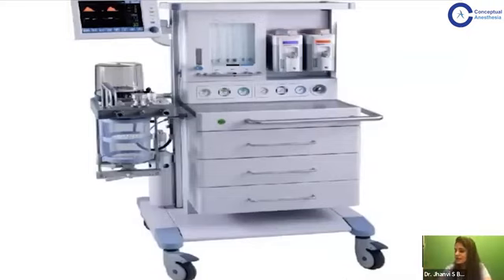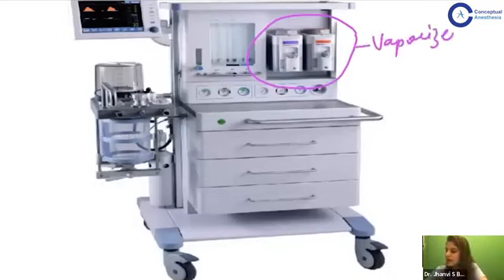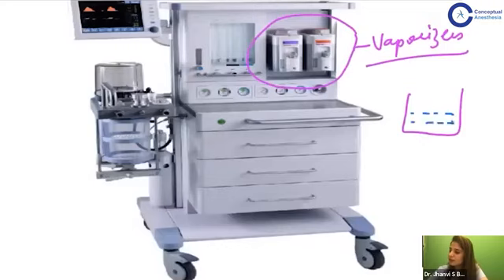So now this is the anesthesia machine, as all of you can see. And what is this that you can see here mounted on the top of the machine? Yes, these two things that you can see, these two dabbas, they are called vaporizers. Okay. What does a vaporizer do? Basically, the vaporizer will have liquid anesthetic agent in it, and it will convert this liquid anesthetic agent into vapors. Okay. So vaporizers actually convert the liquid anesthetic agent into vapors.